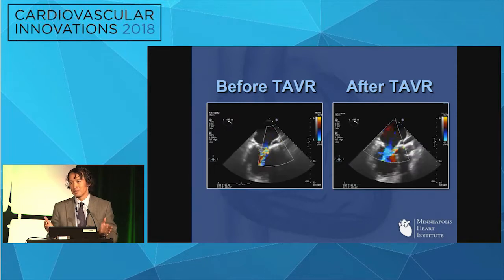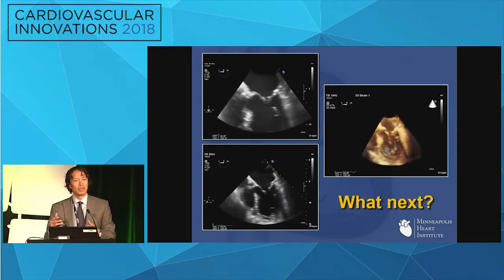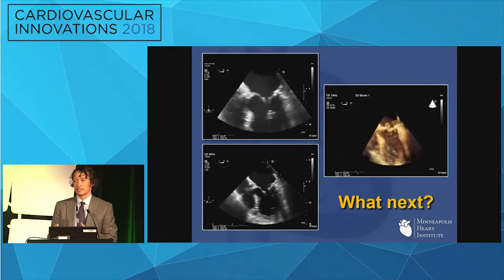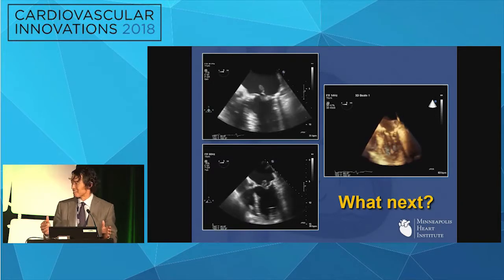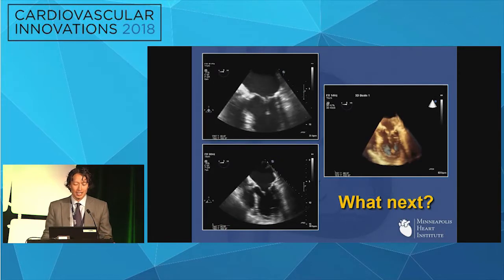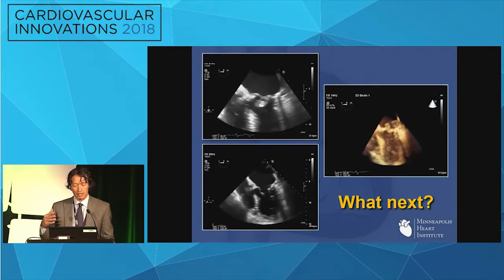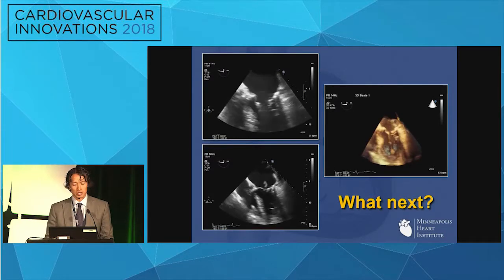So anybody know what happened? All right, we'll keep going here. So obviously, there's a lot more MR after the valve has been put in. And this is what happened. When your echocardiologist asks you what the ACT level is, it's never a good question, right? Because when they see something flapping around, it's never good. So obviously there's a papillary muscle that's been torn and ruptured. It must have happened either during the sheath placement or during the valve advancement. At some point, the papillary muscle got torn.